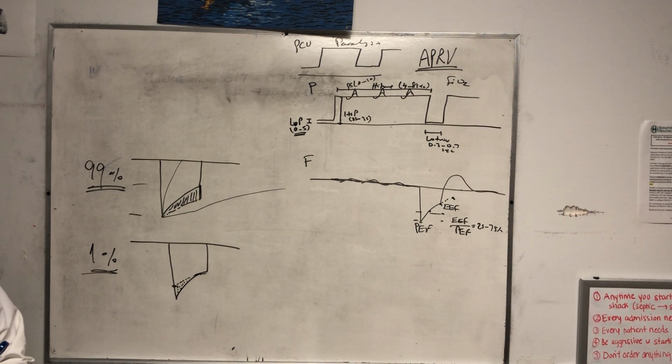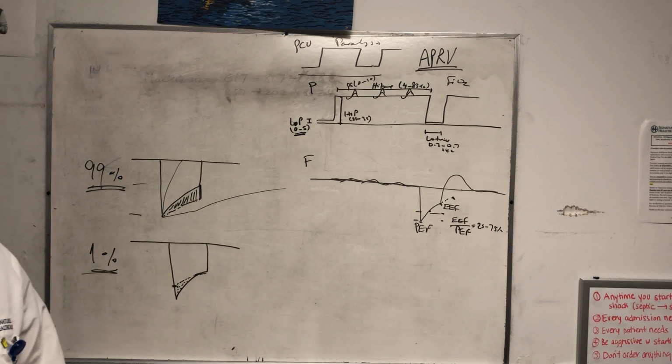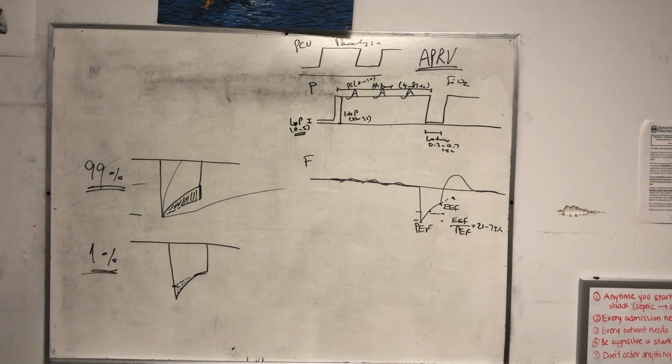That's as opposed to the opposite. If you put the patient on this mode of ventilation and the patient just takes it, and with a good ratio, that means the ARDS nature or the restrictive nature is more prevalent in this patient. All right, and we will stop here.